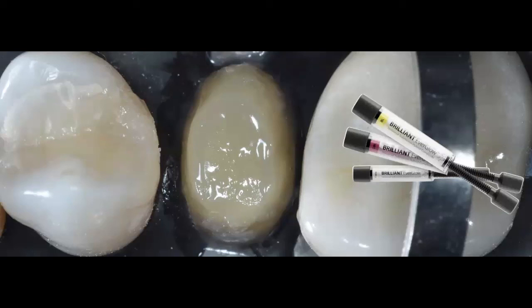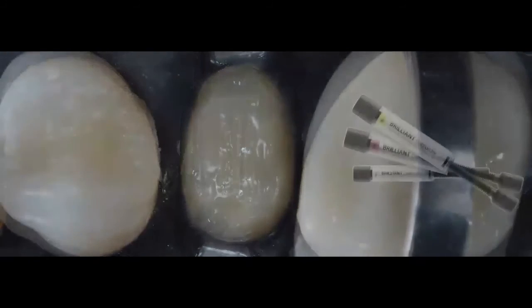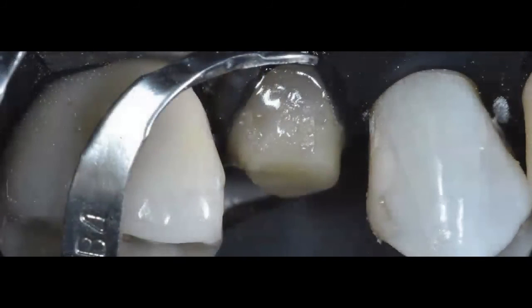But this preparation is more like a plate. If we go back one photo and you look at that photo, that looks more like a flat plate. So I'm literally placing my composite layers 1 millimeter thick over a flat plate, which is going to give me the least amount of C factor. So what I'm trying to do is control the C factor at the time of building up my core. And my core doesn't have to be that tall. Again, this is a biomimetic approach to restorative dentistry. I'm only looking for maybe 3 millimeters of gingivo-occlusal height.